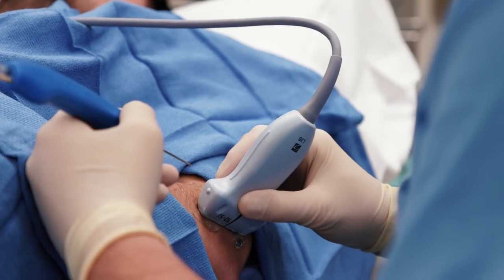TenJet is an outpatient procedure for refractory tendon pain. When patients have tendon pain that hasn't responded to medications and therapy, sometimes we look at the tendon under ultrasound or MRI. What we've noticed is these tendons become thick, and that thick tendon can cause pain and dysfunction.